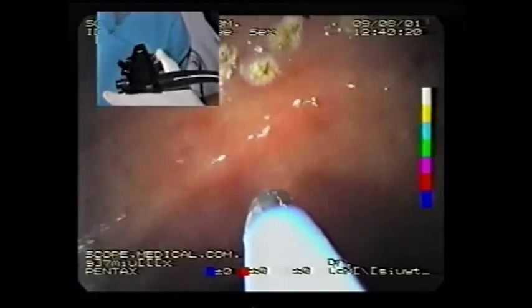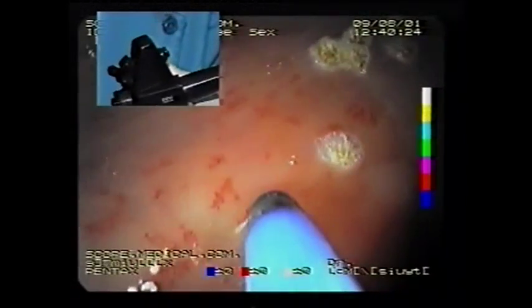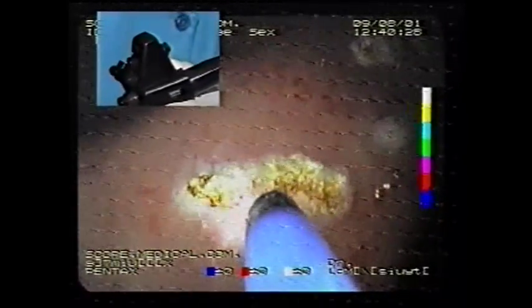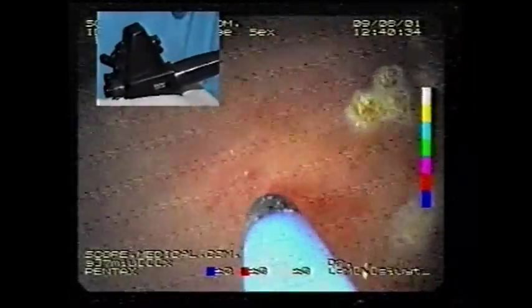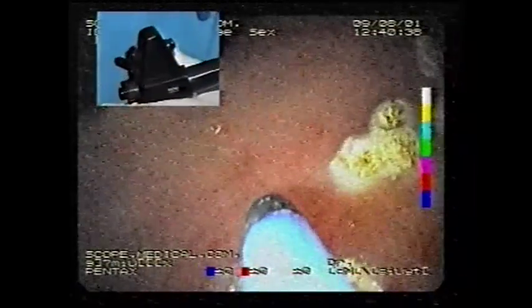So I have the impression I must come very close to the lesion. And what I've done on the piece of meat, I can do it like paint brushing. But I think I must come very close. Something is wrong, because I must come very close. So it's better, yeah.